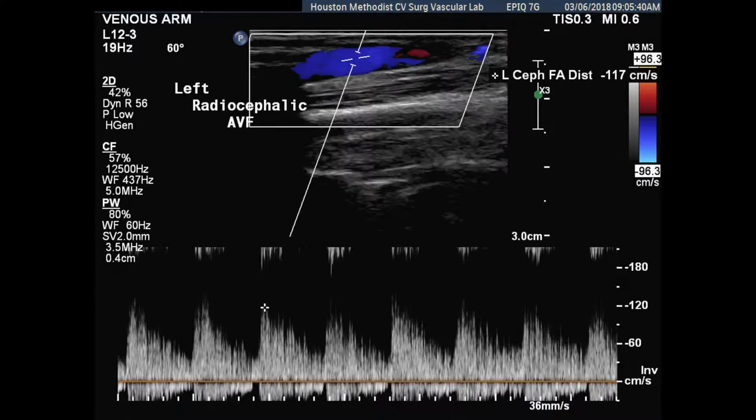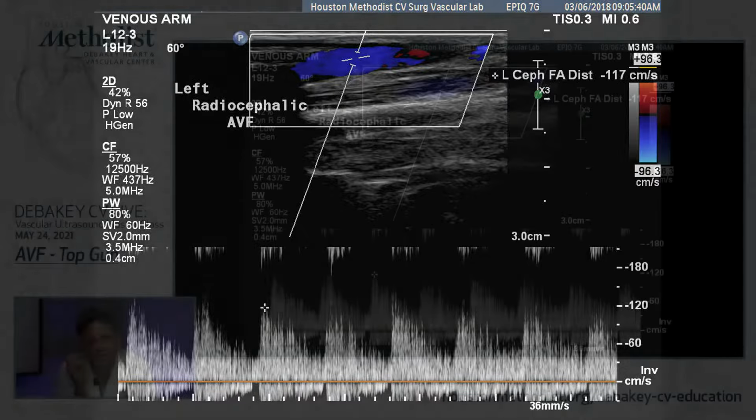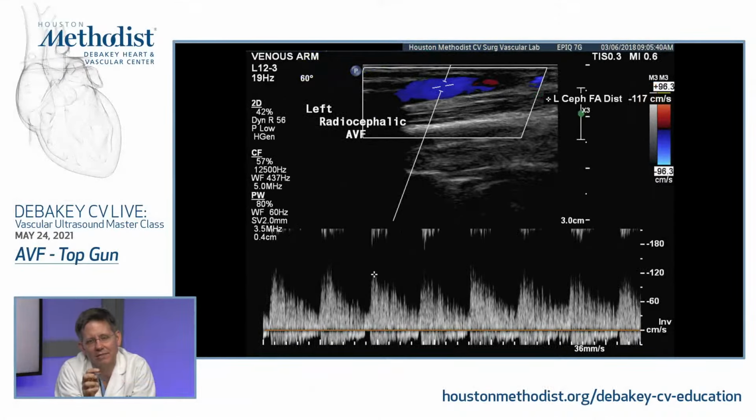So go back to your last one. Yeah, so I think probably what we're seeing here is the jet through that stenosis is still hitting the area of the sample gate, and that's why you're still seeing that brisk upstroke. But when you move further beyond, into the more organized flow pattern where it's become more quasi-laminar, that's when you're seeing the equaling out, and the inflow is blunted. Clearly it's going to be behind that stenosis. Here you're probably just close enough to it, and that's the disturbance we see at the right side of the sample box.